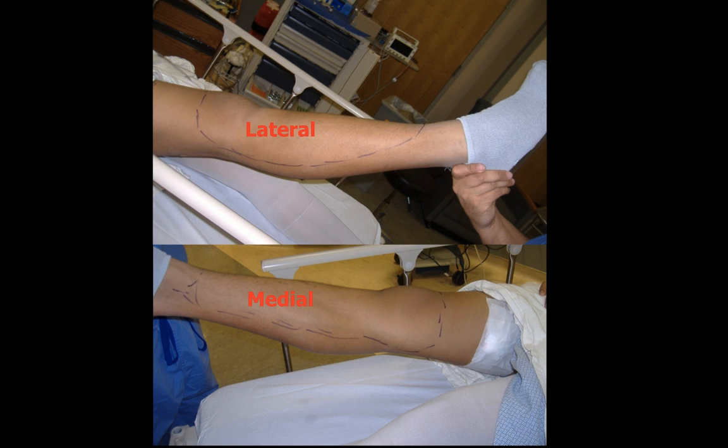The resulting sensory changes after injection at the level of the superior pole of the patella are very similar to those observed after more proximal injection at the level of the adductor canal. Thus, the fenestrated needle provides extensive distribution of sensory loss without the need to inject at the level of the adductor canal.